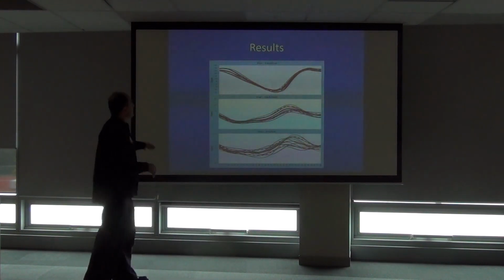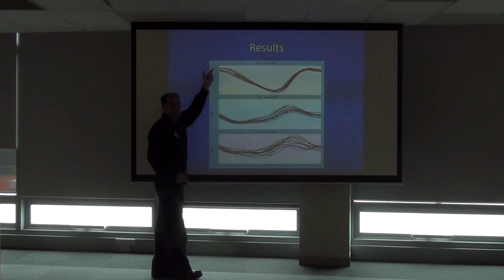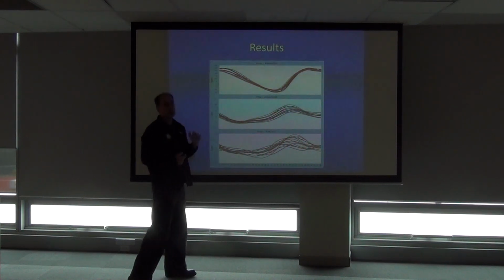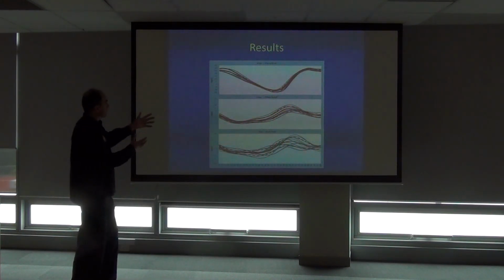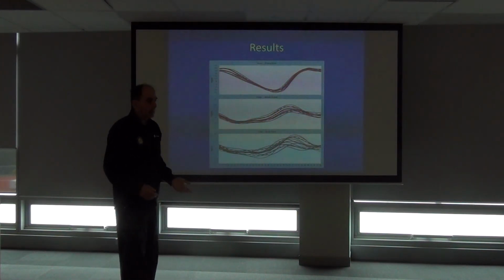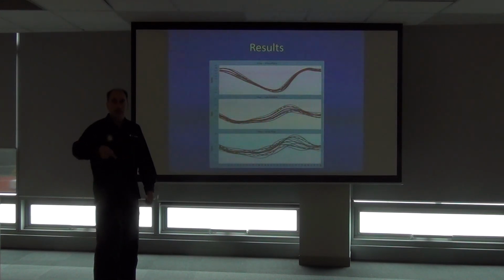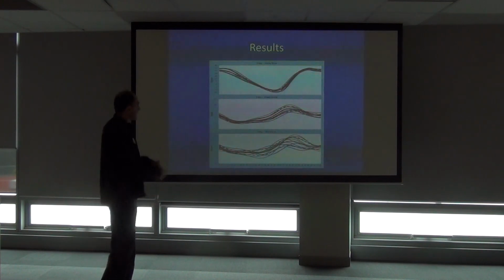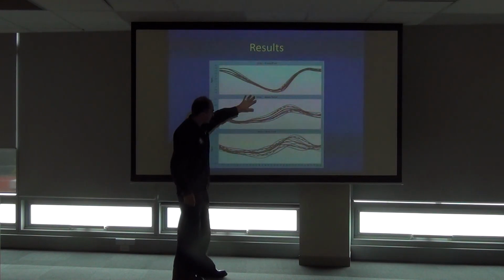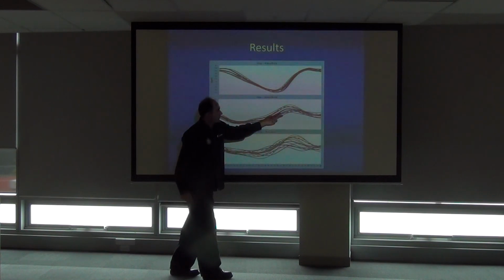There's something interesting in here. There's a group which are lower flexion, or a group of higher flexion, and there's a group in the middle. But you actually start to see, if you get reliable data, some patterns going on here. Now there's only 10 subjects, so it's very speculative. You'd have to do this again with maybe a whole lot more subjects to see whether this occurred on a consistent basis. But there are some patterns here, and you see it here in abduction adduction of the hip and in the internal external rotation. There's a group of increased and decreased.